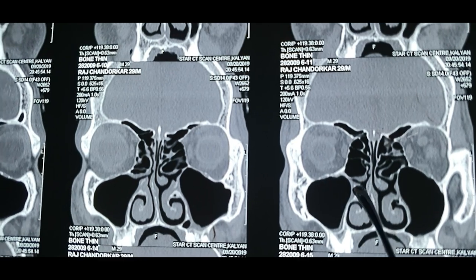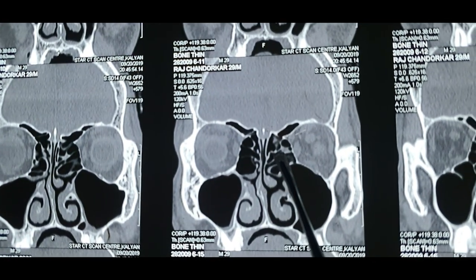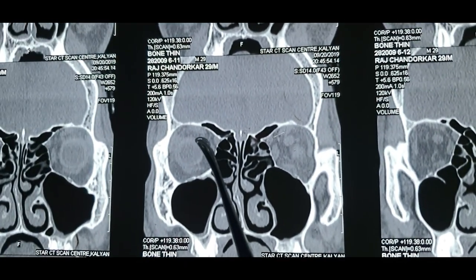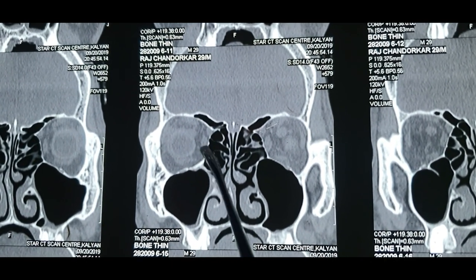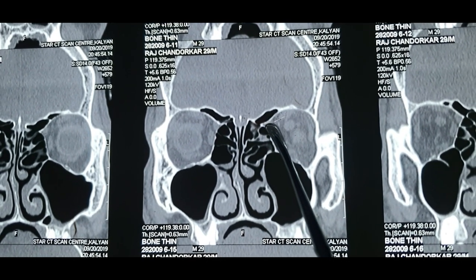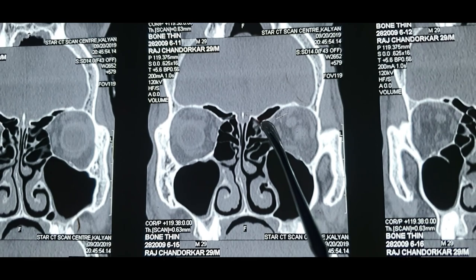So this was the ground lamella. See, this was the ground lamella here. So this is a posterior. See, this is still circular. I will say this is still circular, the level of the artery. So the anterior ethmoidal artery lies immediately anterior to the ground lamella.